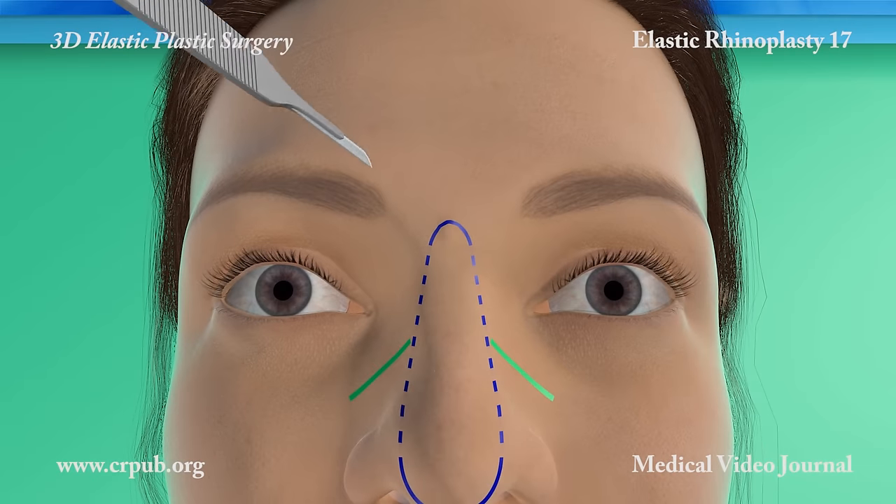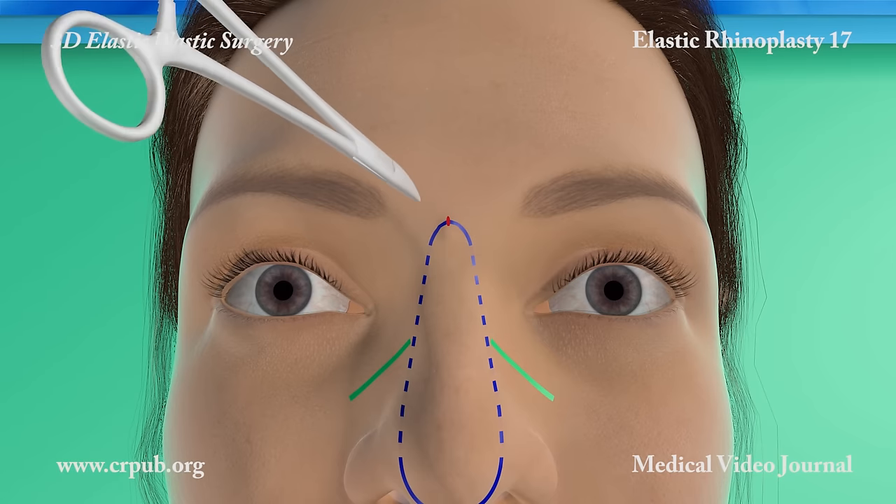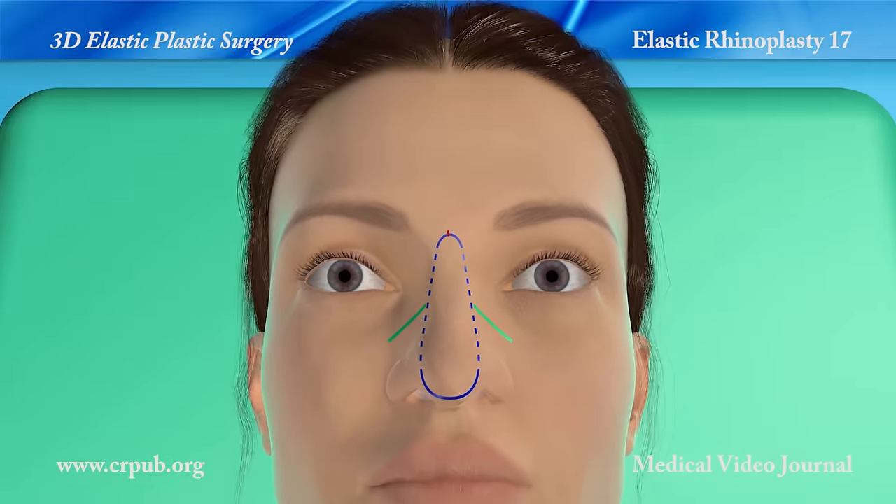A skin incision is made with a microsurgery scalpel. A fine clemmer is used to create a deep cavity to house the knot.